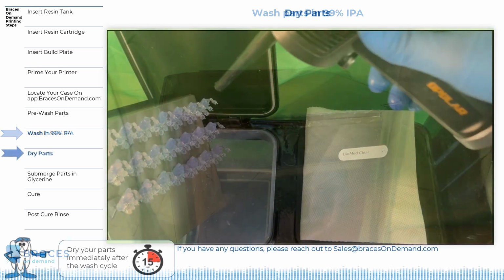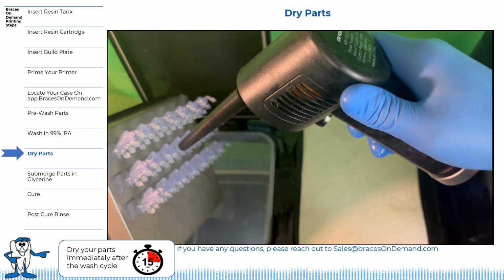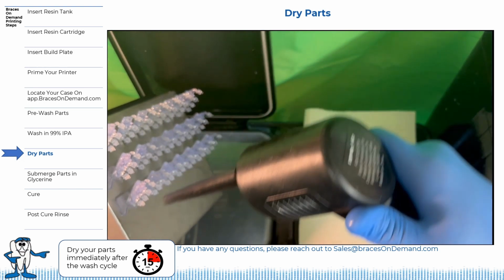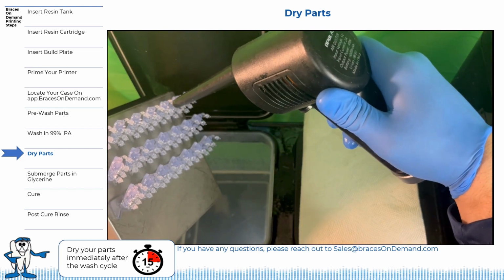Next, it is important that you wash your parts for Braces on Demand's recommended time. It is also important that you do not overexpose your parts to alcohol. We recommend that you set a timer to inform you when the wash is complete. Then, gently blow dry your parts.